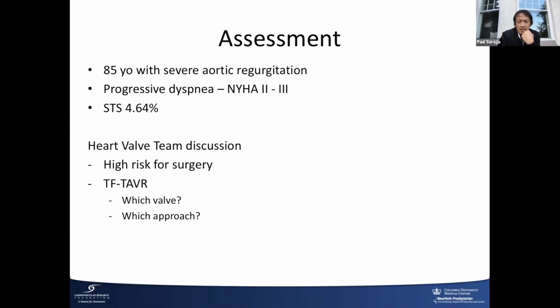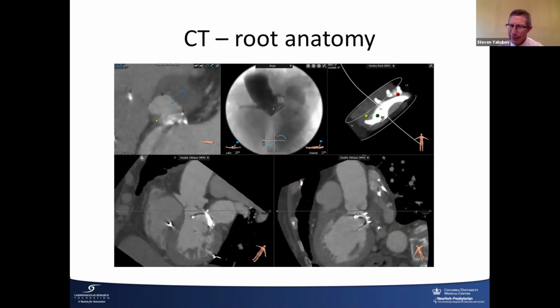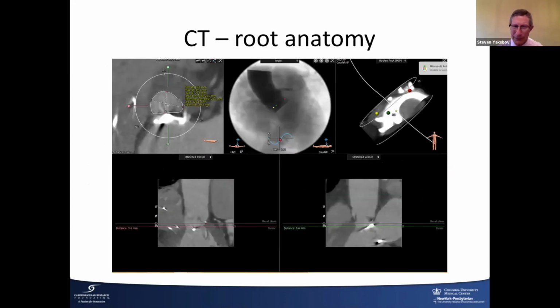I didn't see any aortic calcification. No, the calcium score was 0, actually. It also looked like her sinuses were kind of effaced. I know you said they were adequate size, but they look a little shy. Yeah, they're like 28, 27, 28. The aorta STJ is 32. Sort of, you see it gets bigger there.